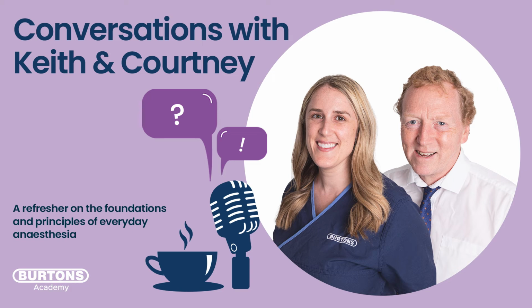But I think the essence here is that the character and behavior of our capnogram tells us an awful lot about how that animal is breathing, how well it's breathing, and how easy it's finding it to breathe out or breathe in, and what it's breathing out and what it's breathing in. So there's a huge amount of information. We've only given a couple of examples, but those are the types of things in capnography where we can really pick up what's going on with the animal's respiration and ventilation.